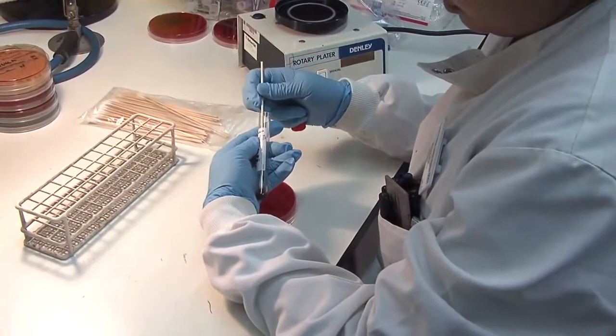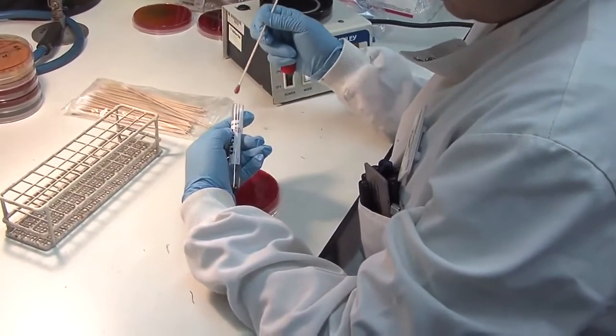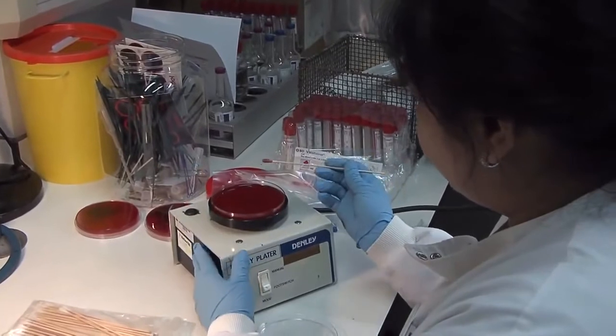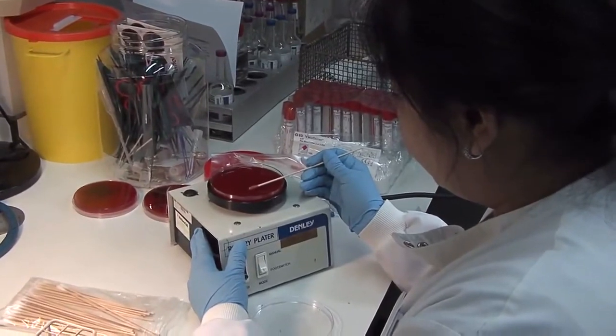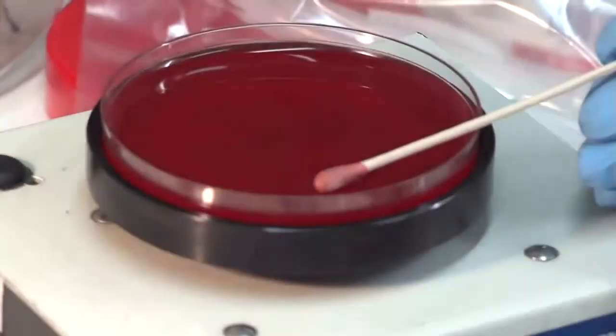Direct antibiotic disc susceptibility tests are also performed on the positive blood culture. Either a direct inoculum of the blood is used or a diluted inoculum, dependent on the organism. This is spread onto a sensitivity testing agar using a rotary plater to create an even semi-confluent inoculum lawn.